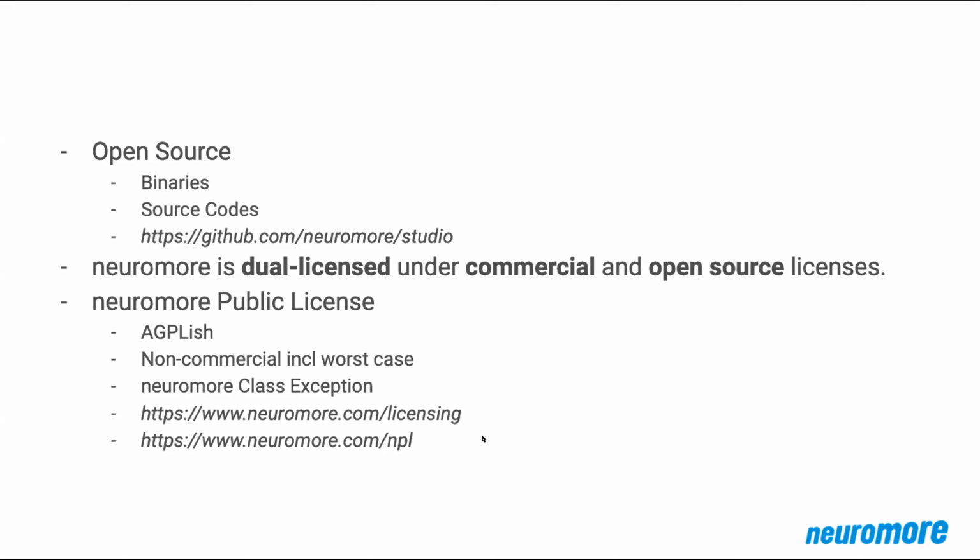We distinguish between changing our core system, in which case, under the public license, you also have to share all the changes that you made, and having your own device where you create your own input node, and then your own machine learning node.